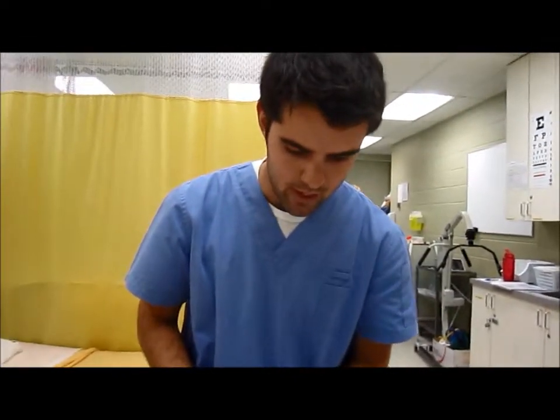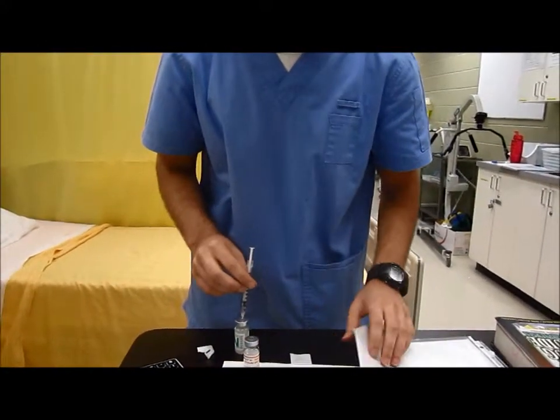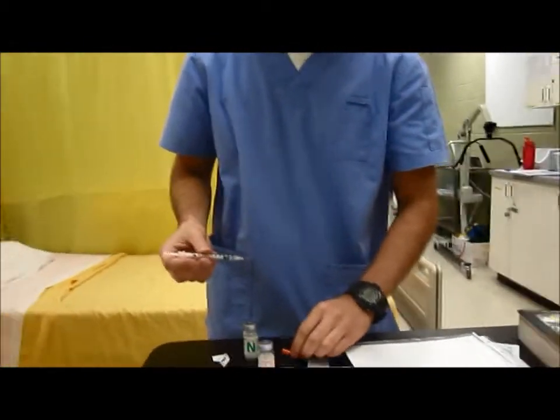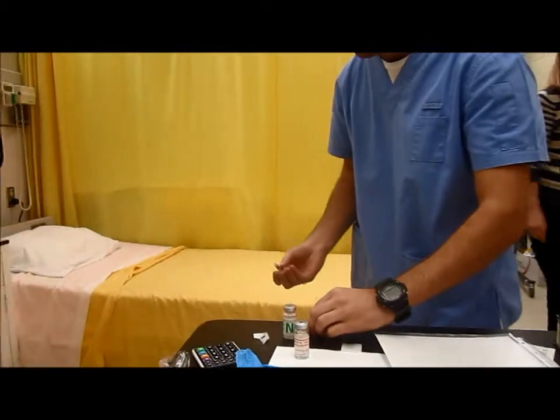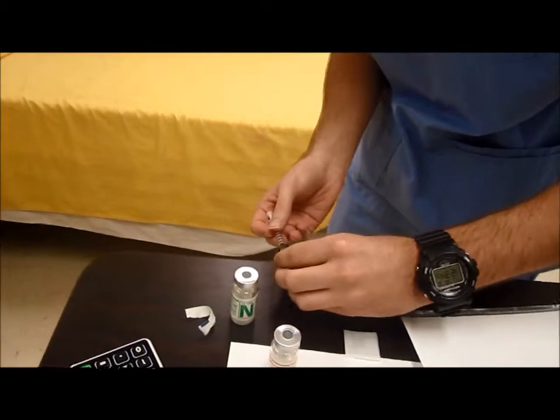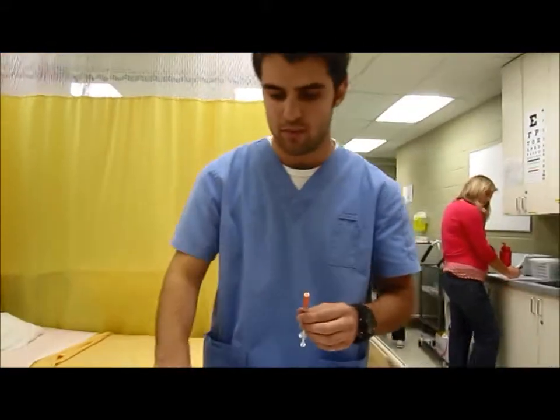So there's 20 units of insulin here. And before I give it to my patient, I would need to double check with another nurse. So I'd ask another nurse, is there 20 units of insulin in here? Yes. Perfect. So then I would sterilely recap my needle. I can only put it in the right side. Lock it, and then I would go to my patient.